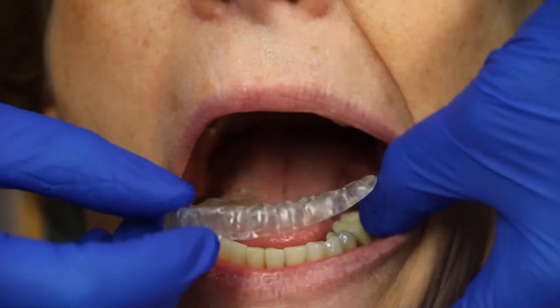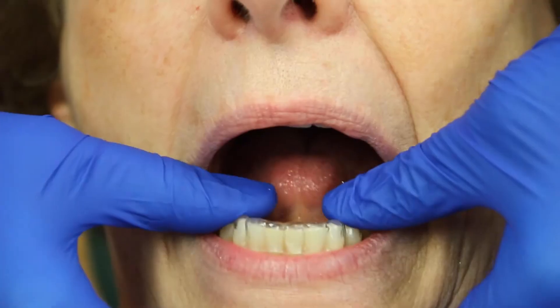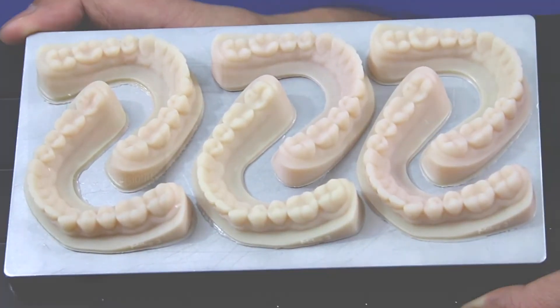We have an excellent rate of it fitting the patient. We actually haven't had a single problem with one of them fitting. Occasionally we'll order out other retainers from other labs and they'll have used a different printer. The models are not quite as accurate as the models that we make here with the Envision Tech. So we're very impressed with the accuracy on this fantastic machine.